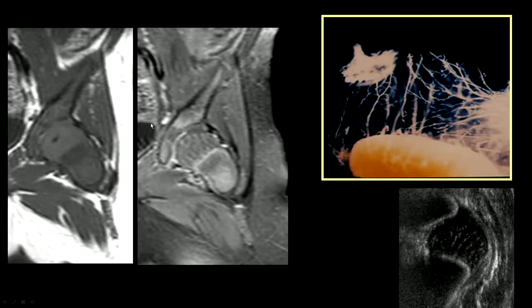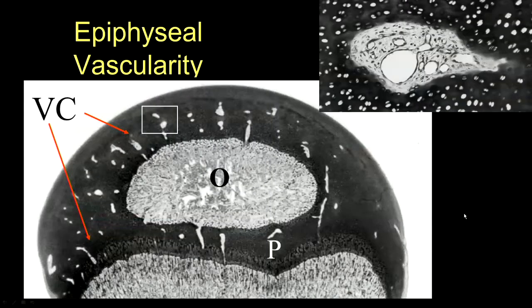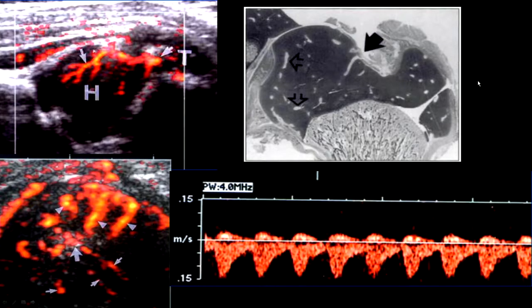In order to see the vascularity of the femoral head, we have to look at the vascularity of the proximal femur. This is T1 without gadolinium and T1 with gadolinium. You can see multiple vascular canals within the femoral head, which you can also see on an injected specimen. Within the cartilage, you don't have a capillary network — rather, the vessels go within these vascular canals that you can see with ultrasound and post-gadolinium. These are tubules within which the vessels course. If you see flow within these canals, that's an indication that there is perfusion of the femoral head. You can see multiple vessels with Doppler, either color or power Doppler.